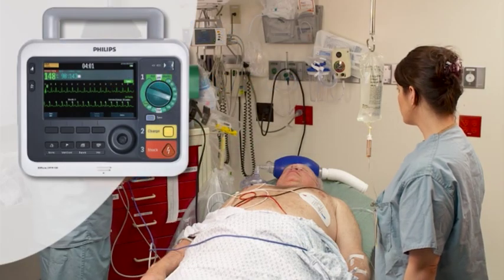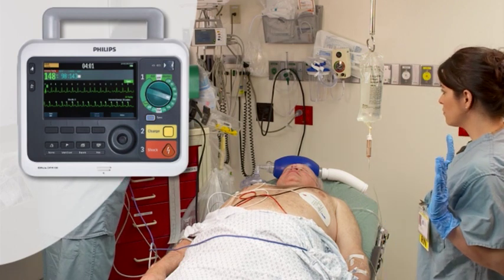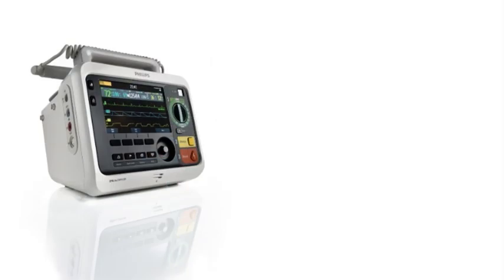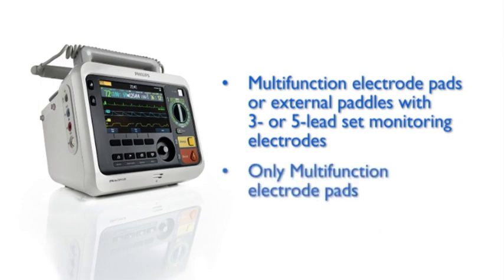With synchronized cardioversion, you deliver a shock synchronized to the R wave of the ECG being monitored. You can perform synchronized cardioversion with multifunction electrode pads or external paddles and three or five lead monitoring electrodes directly connected to the DFM 100, or only the multifunction electrode pads directly connected to the DFM 100.